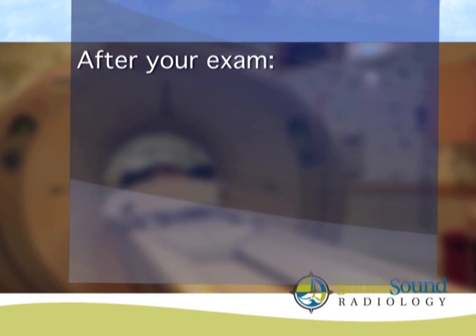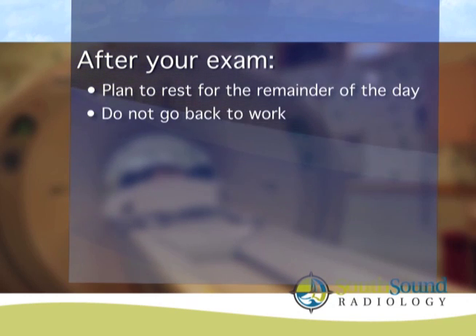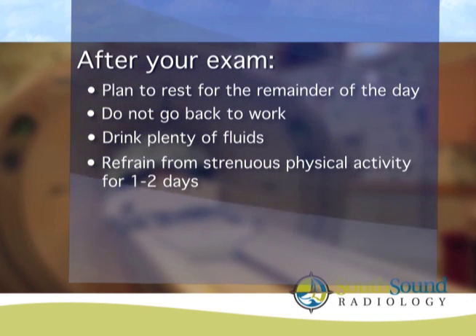It is important that you plan to rest for the remainder of the day and do not go back to work. Adequate hydration after your exam is very important. Take plenty of fluids to help eliminate the contrast material from your body and to prevent a headache. Following your CT myelogram, you should refrain from strenuous physical activity and from bending over for 1 to 2 days.